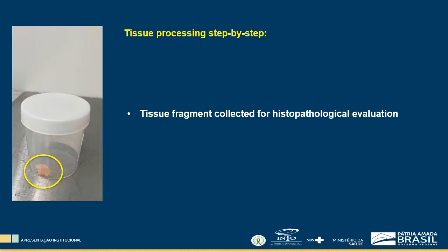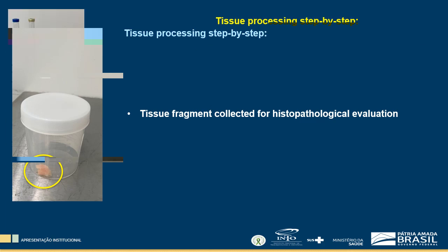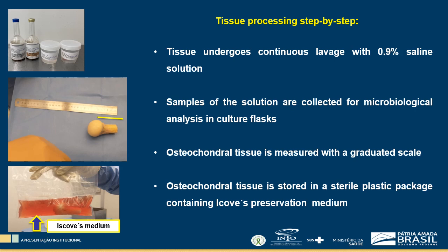At the end of this step, a tissue fragment is collected for histopathological evaluation. The tissue then returns to table 1 for continuous lavage with 0.9% saline solution in a second flask. Then, tissue is dried with sterile compresses and transported to table 3, where osteochondral tissue is measured with a graduated scale.